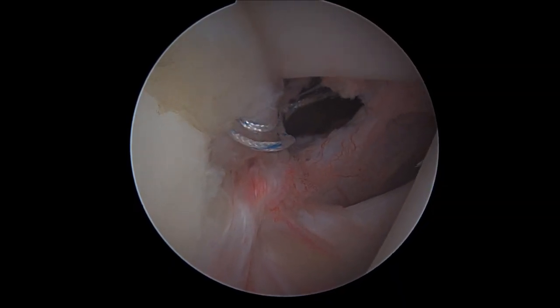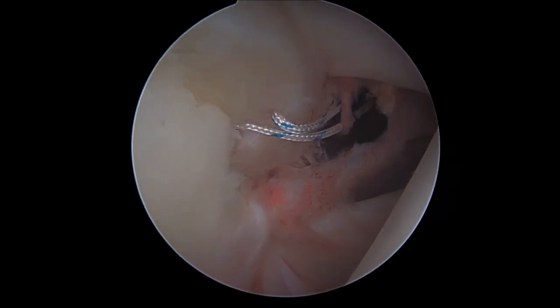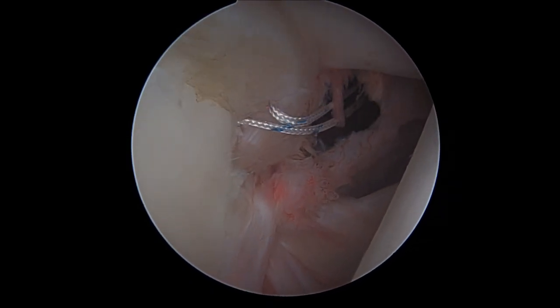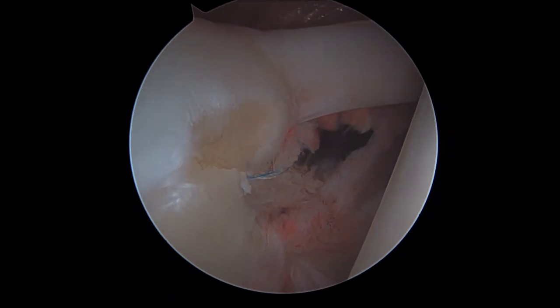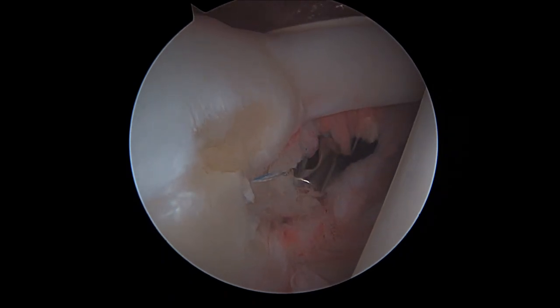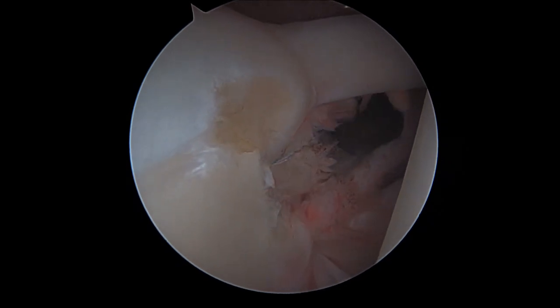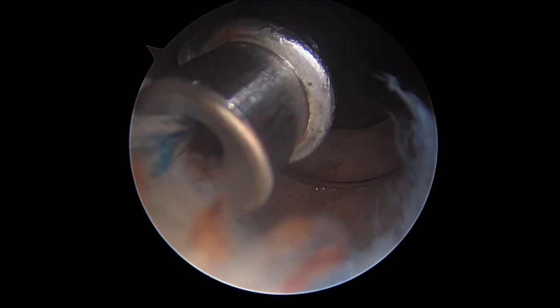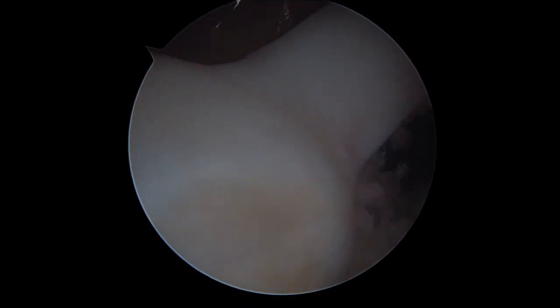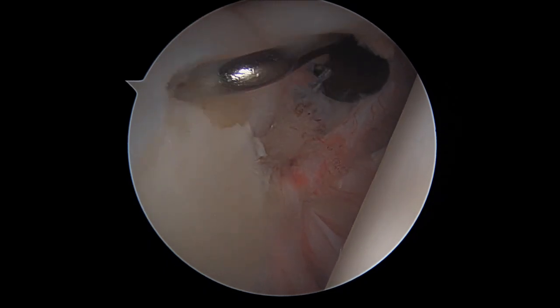Once we have recovered one of the two sutures, we are ready to knot our wires and to finally stabilize the anterior superior aspect of our SLAP tear, even though we have to be very careful not to over-constrain the intra-articular portion of the tendon of the biceps, because it may be a cause of future painful residual symptomatology, above all in overhead elevation and external rotation for the patient.